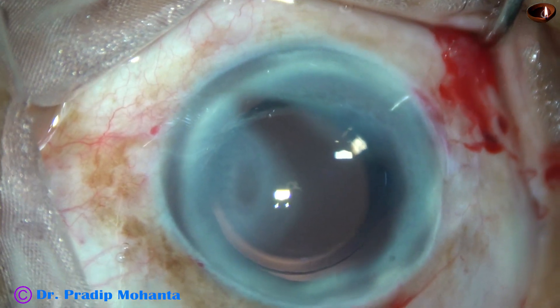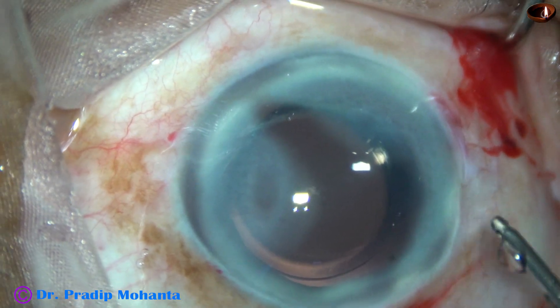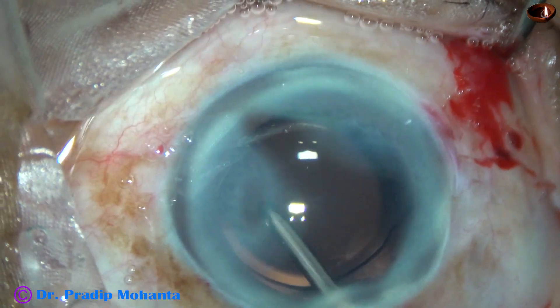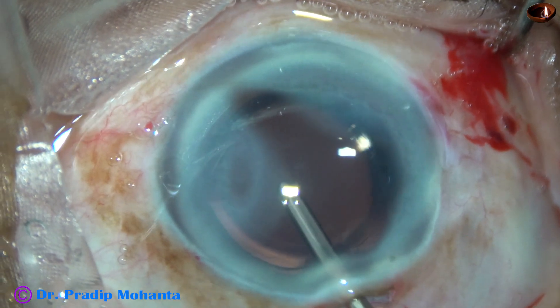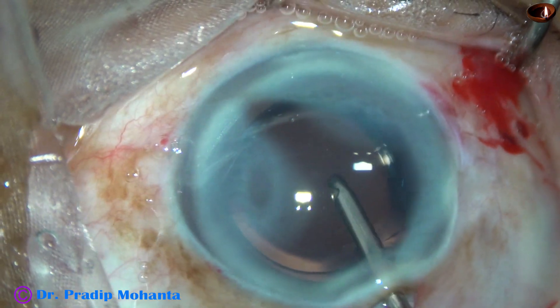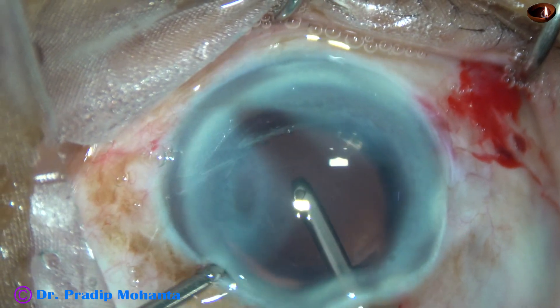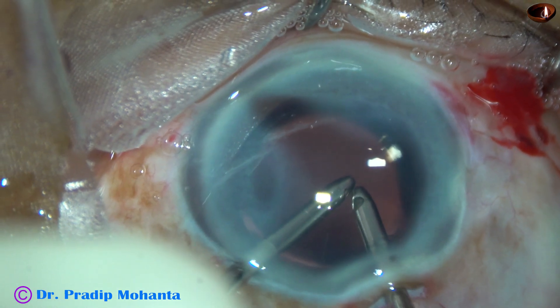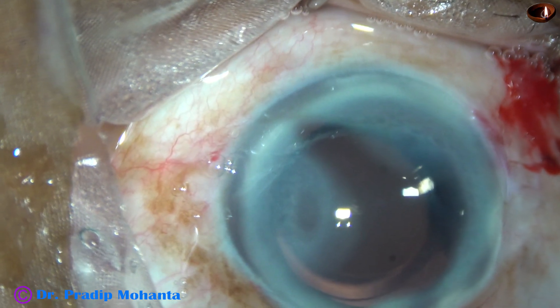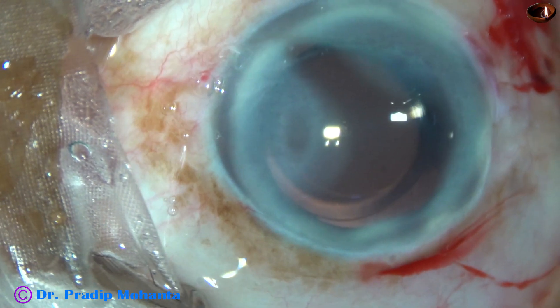And now this is cleaning by bimanual irrigation-aspiration — first using the irrigating probe, irrigating the anterior chamber. This is irrigation and aspiration being used together. The capsular bag has been irrigated by Simcoe already, so it was not necessary again.